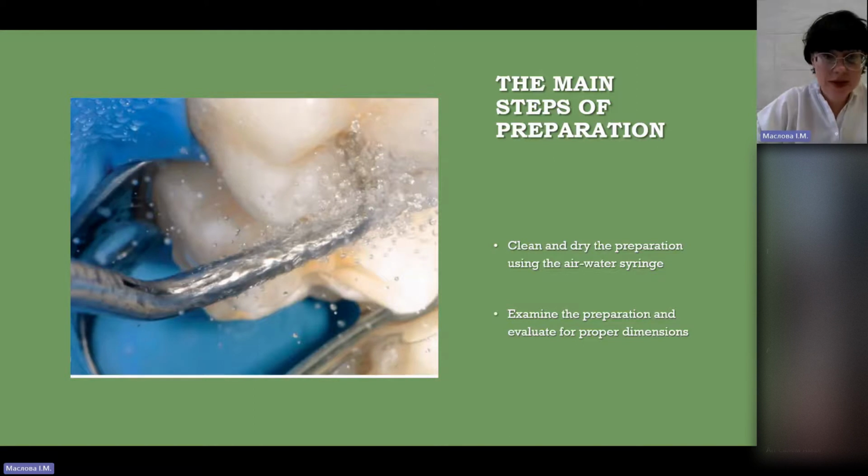Next, what you have to do is understand what position to hold the dental mirror, and for what aims you need this instrument. Position of the mirror to achieve indirect vision of the preparation. Place a wedge in between the adjacent teeth to separate the contact areas.